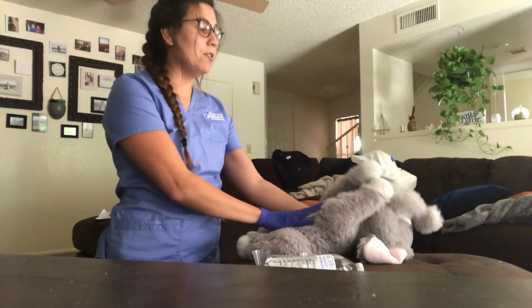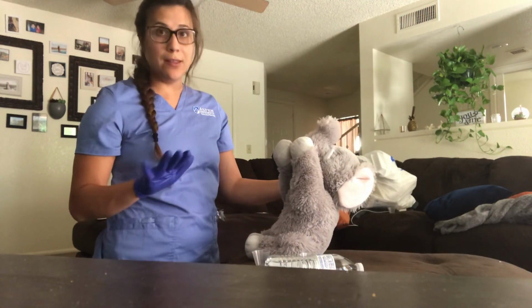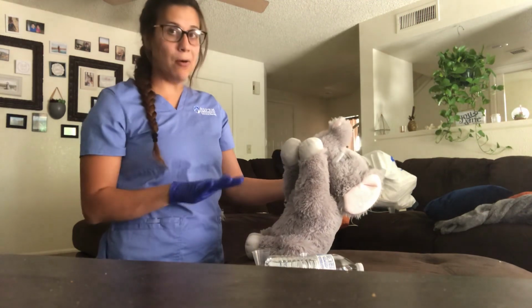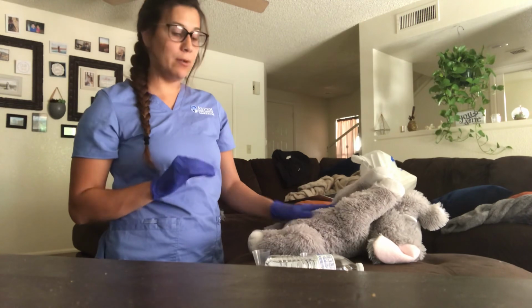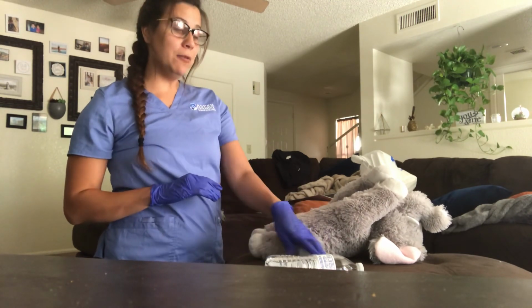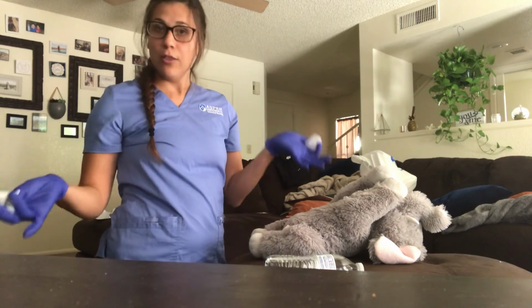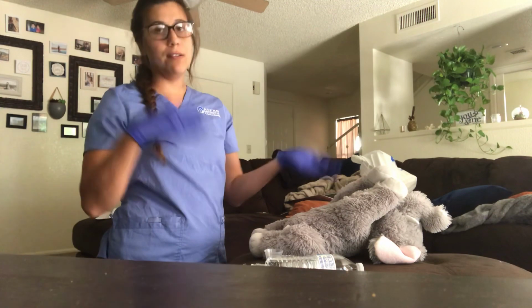So the patient is supposed to be up in a 45-degree angle. The last thing that you want to do is tell the patient to stay upright for 1 hour. After that 1 hour, they can go ahead and lay down, but they have to stay upright for at least 1 hour in case of any aspirations. And then you would just go ahead and take your supplies, throw away everything, perform hand hygiene, and leave the room, and then obviously come back and check your patient.